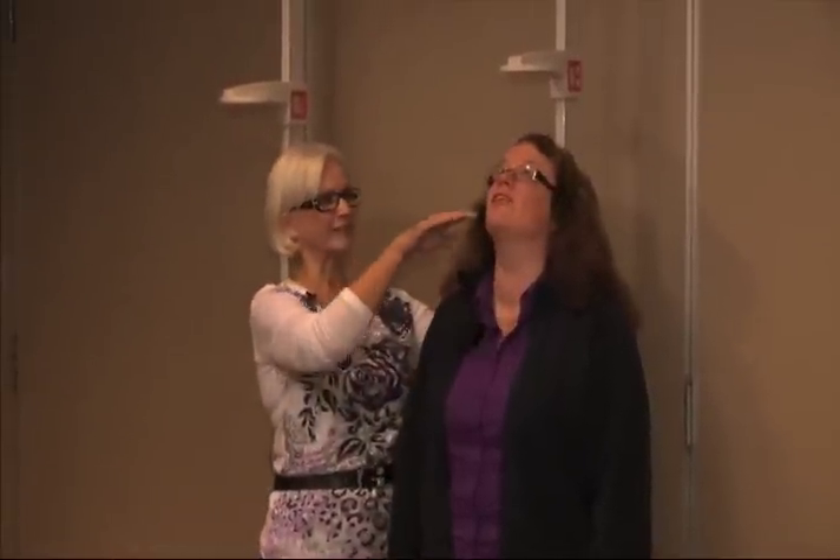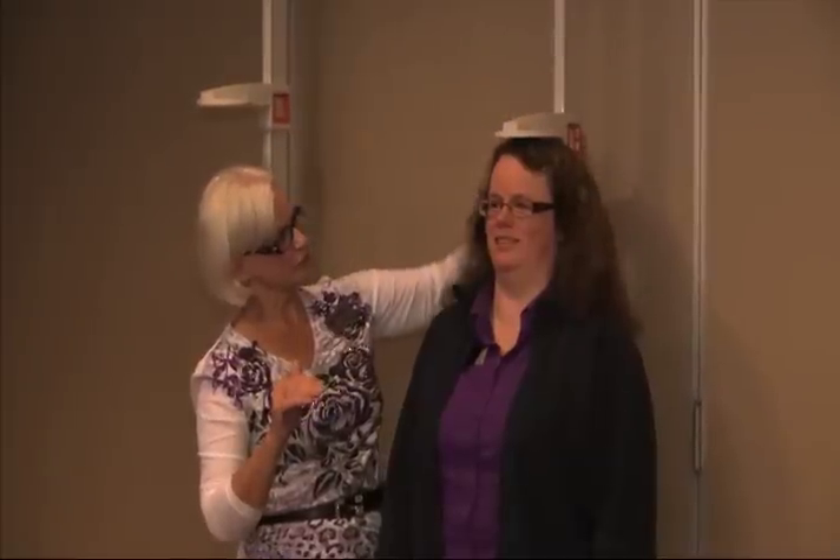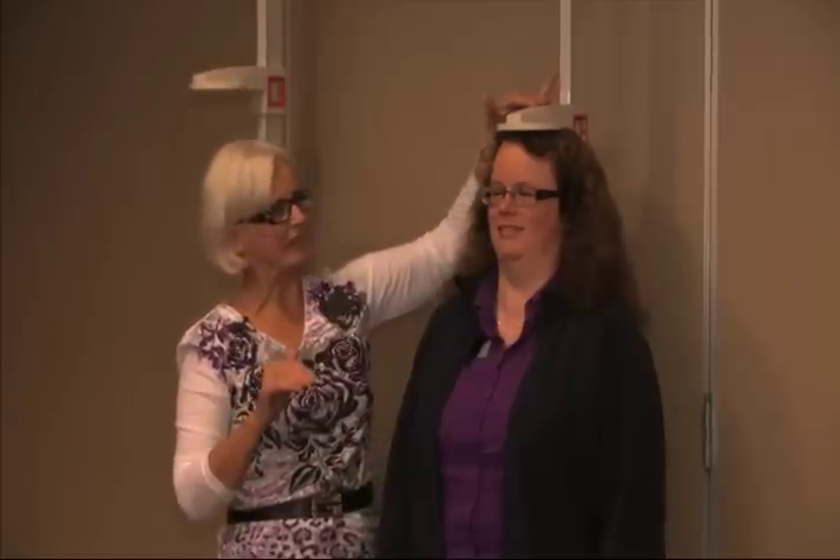One thing I watch for as a therapist especially is whether they're looking up or looking down, trying to look taller by looking at the ceiling. You definitely want to look at them side-on to make sure they're looking straight ahead. Then we'll just slide the little tool down until it touches. I tell them I want it to touch — touching but not crushing, just a gentle pressure. Sometimes if they have nice thick hair, you're going to have to put a little compression on it. I've got a reading here of five foot four and a quarter inch.